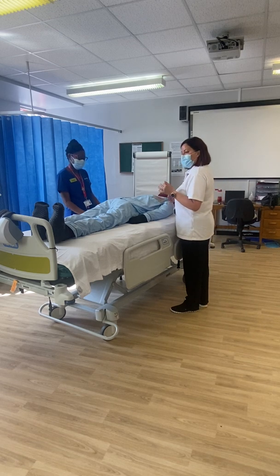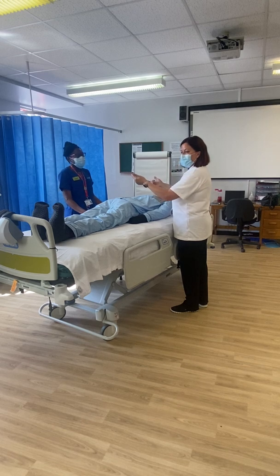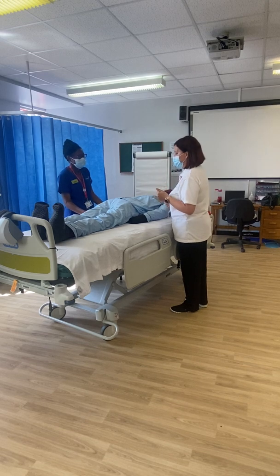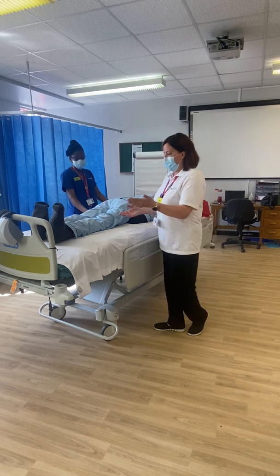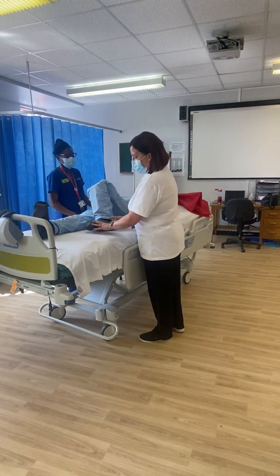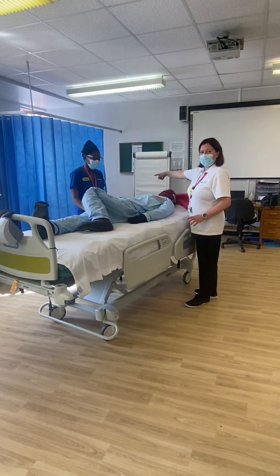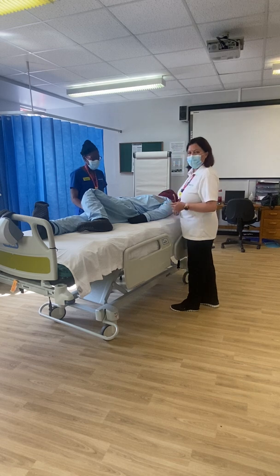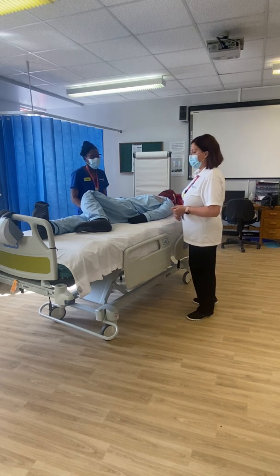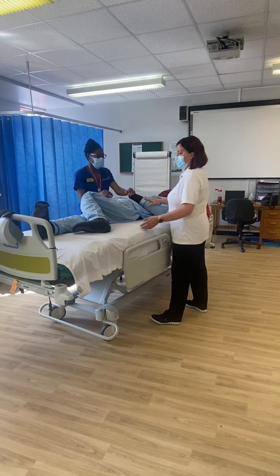So what we're going to do this time is that we're going to roll the patient away from me towards Priscilla and then put the slide sheet in underneath. So as we've done before, we're going to bend the patient's leg, ensuring that the foot is flat on the bed. We're going to ask the patient to look in that direction, move the hands slightly away from the body so they don't roll on it, and then put the patient's hand across their body.